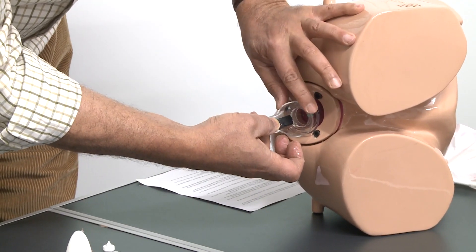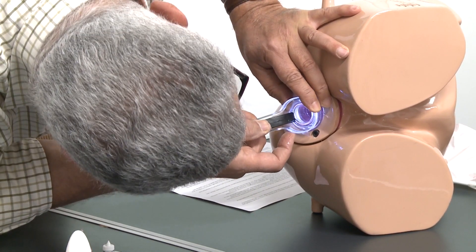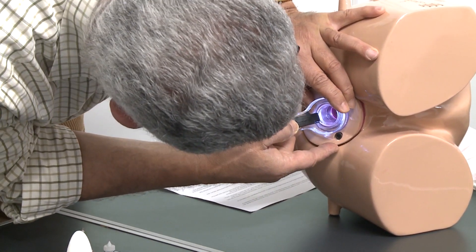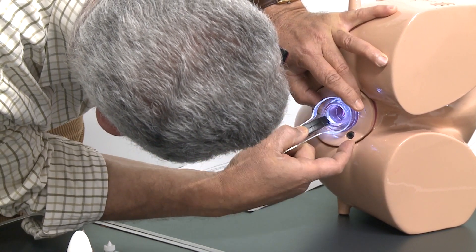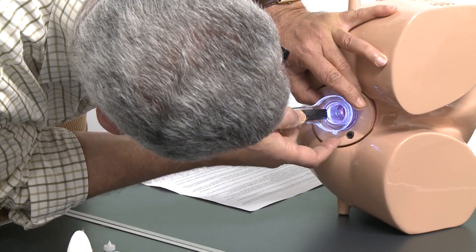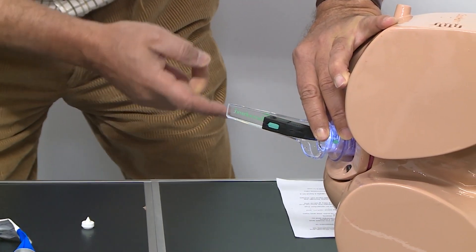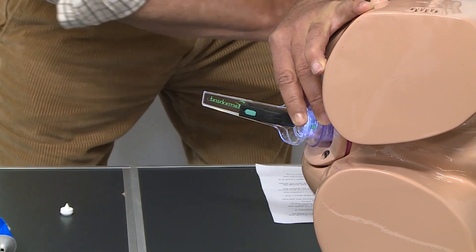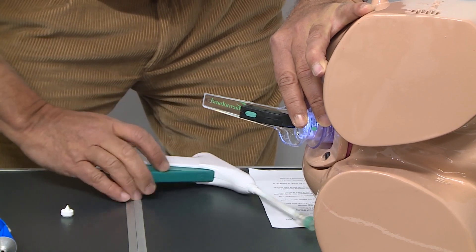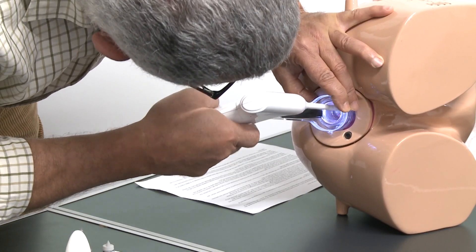Having done that, we can turn the light on and see inside. We can look here and see — because of the size of the scope — we can see the hemorrhoids. We can steady the scope and the sleeve inside, and if we like to do banding, we can go in and do the banding.